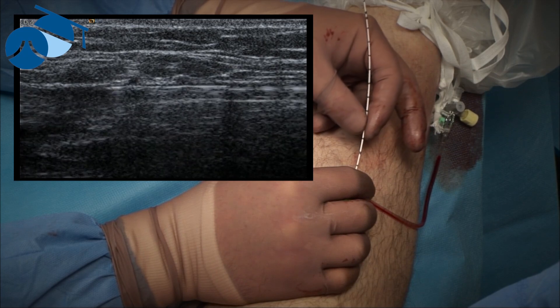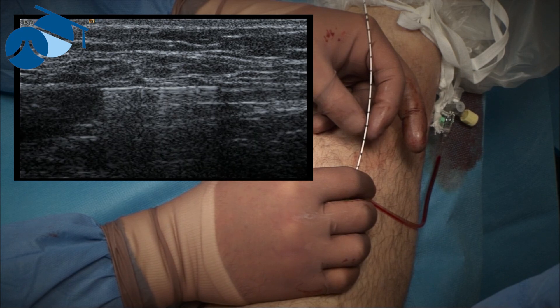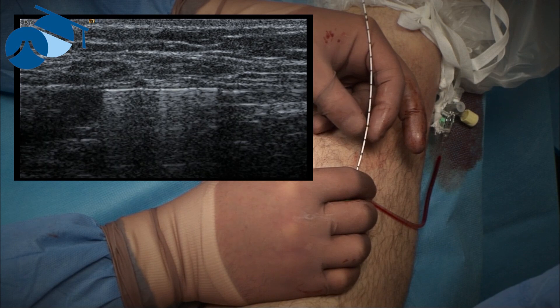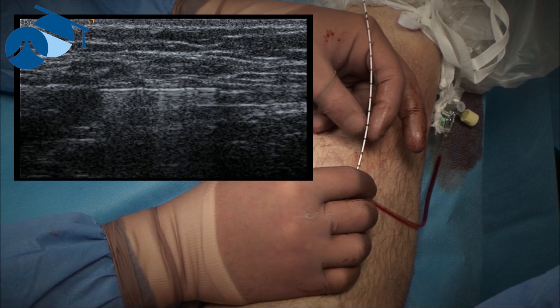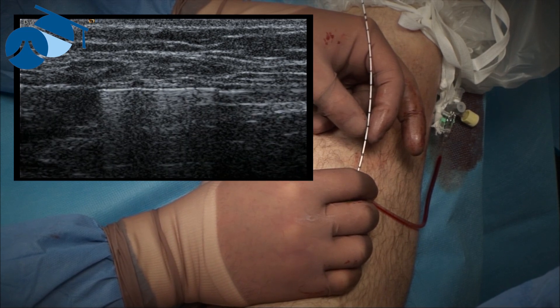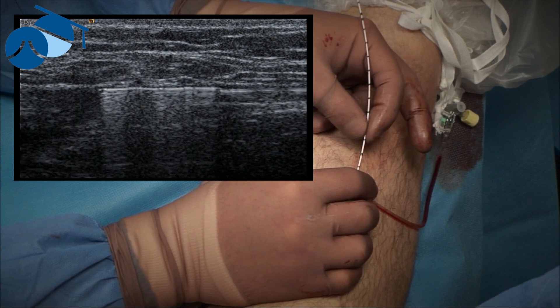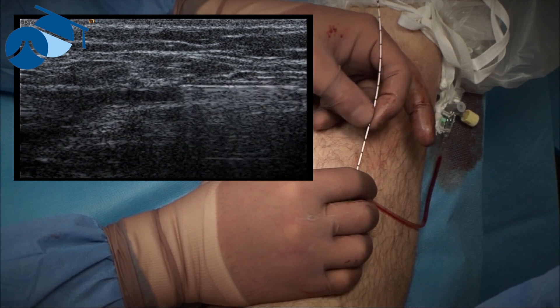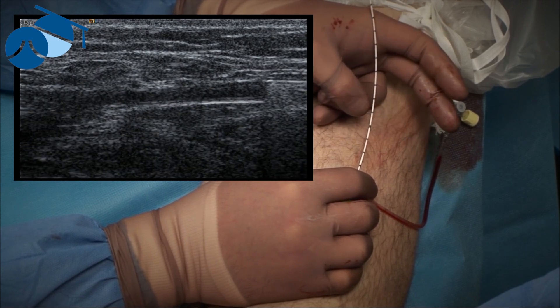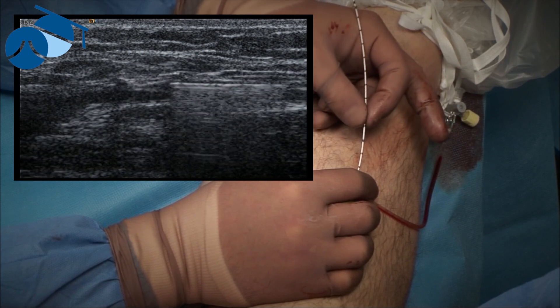This is a radial firing system, so we bring it back just a little so we can see it's exactly where we want to start treating, leaving only the smallest hood if any at all. Usually when we see the post-operative view, that will come down to a flush ablation. With the older end-firing catheters you must come back two centimeters, and there's some guesswork as to how far forward the vein would be ablated.